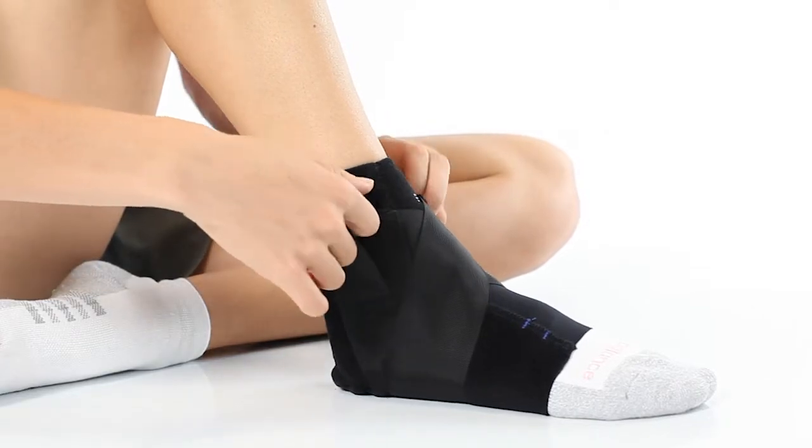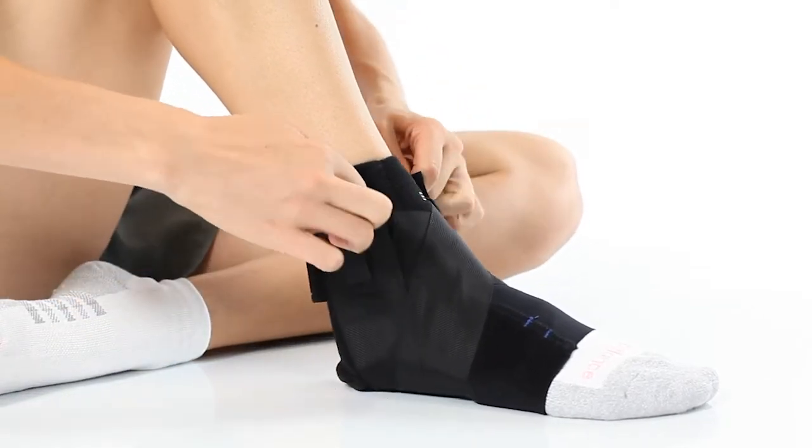At this point, detach both sides of the stirrup strap and pull them up firmly and reattach.